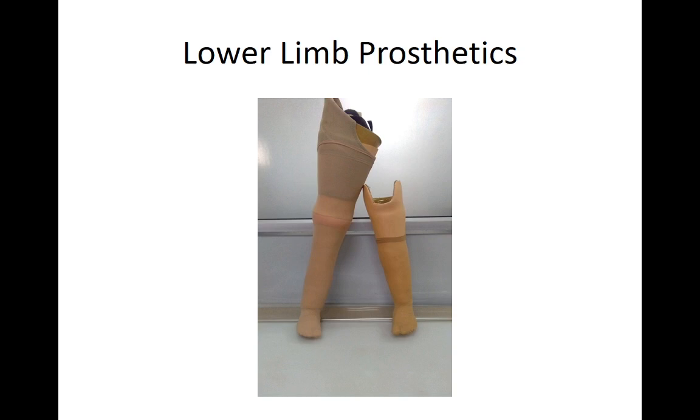Now, an important thing about care of the limb also. Sometimes a patient, after having pain from using a prosthesis, develops a little bit of scarring of the overlying tissues. Sometimes there is a breakdown of the skin. The patient doesn't know and keeps on using the prosthesis. That might lead to secondary infection again. So it's very important to tell the patient that in case of any scarring or breakdown of the skin, the patient needs to stop using the prosthesis for a certain number of days. It's not that you continue using it; you have to stop using the prosthesis.